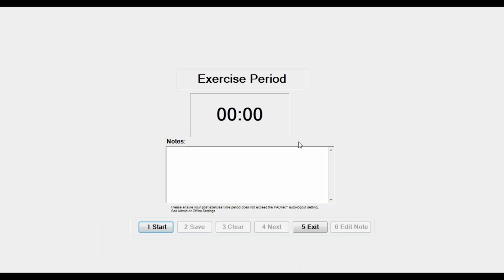So this is the exercise screen. You simply start the exercise while the patient's walking on that treadmill. The timer up on top will start counting up to the 5-minute mark, and then there's a section here for notes. So if the patient experiences claudication, say 3 minutes of the way through the test, rather than allowing it to go to the full 5, you will stop it at 3 minutes and then put in the notes why the test was stopped, and then you're basically going to redo that study and take different segmental pressures at 2-minute increments, until the patient returns to baseline.